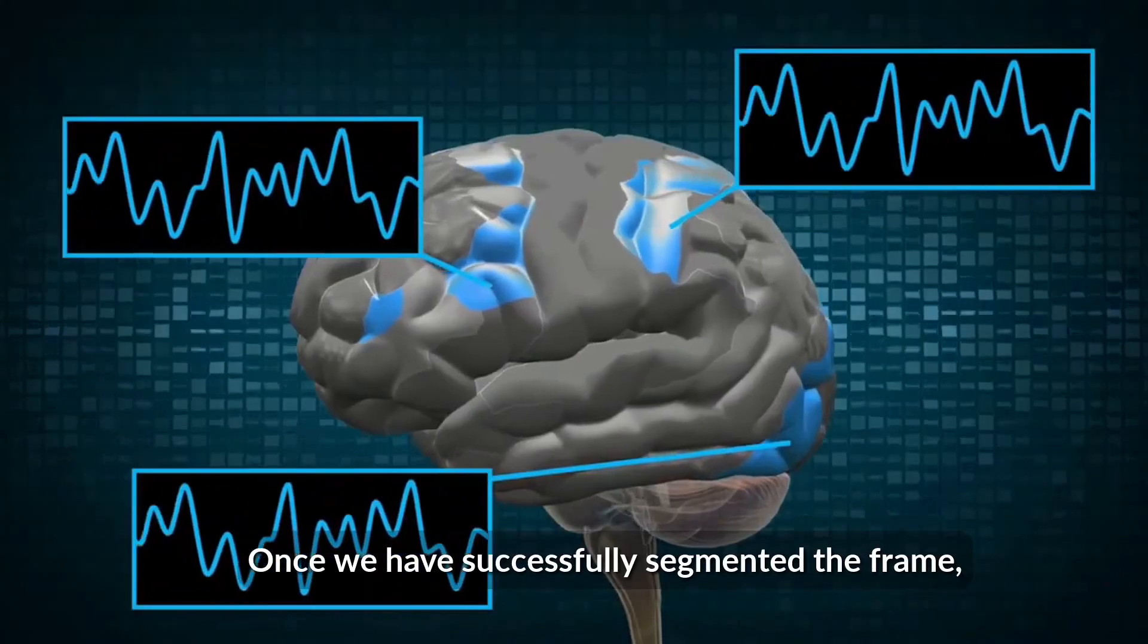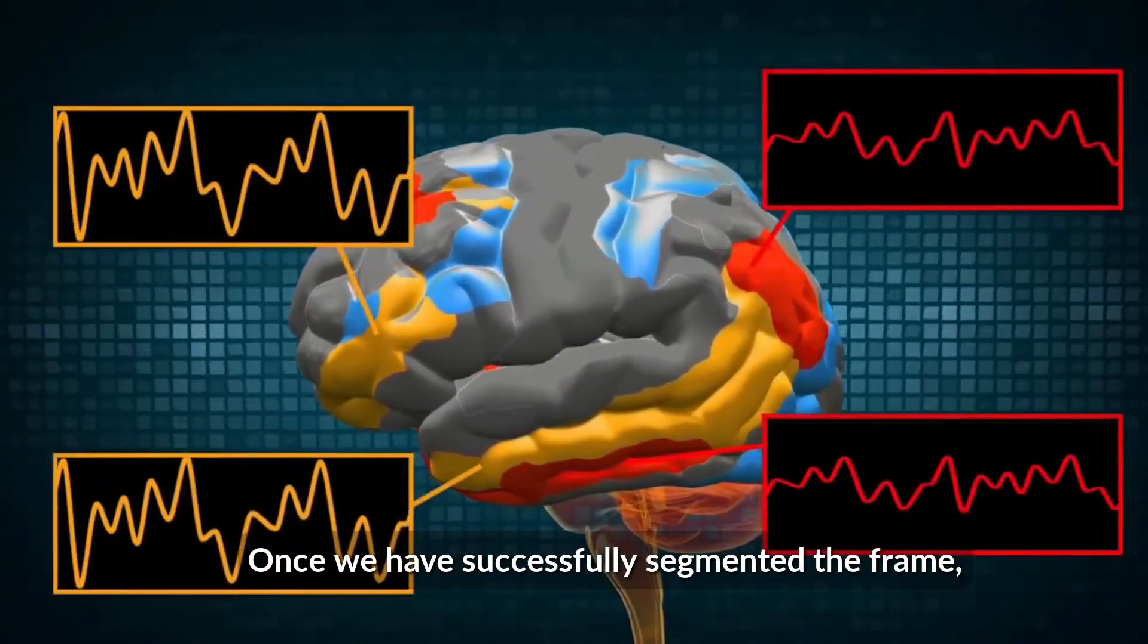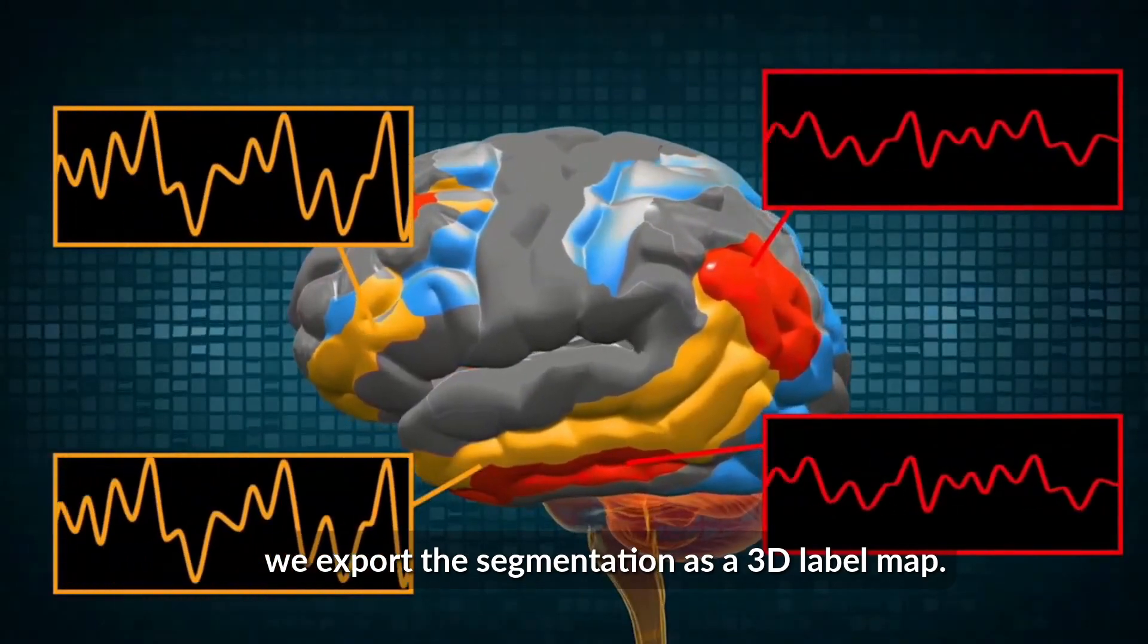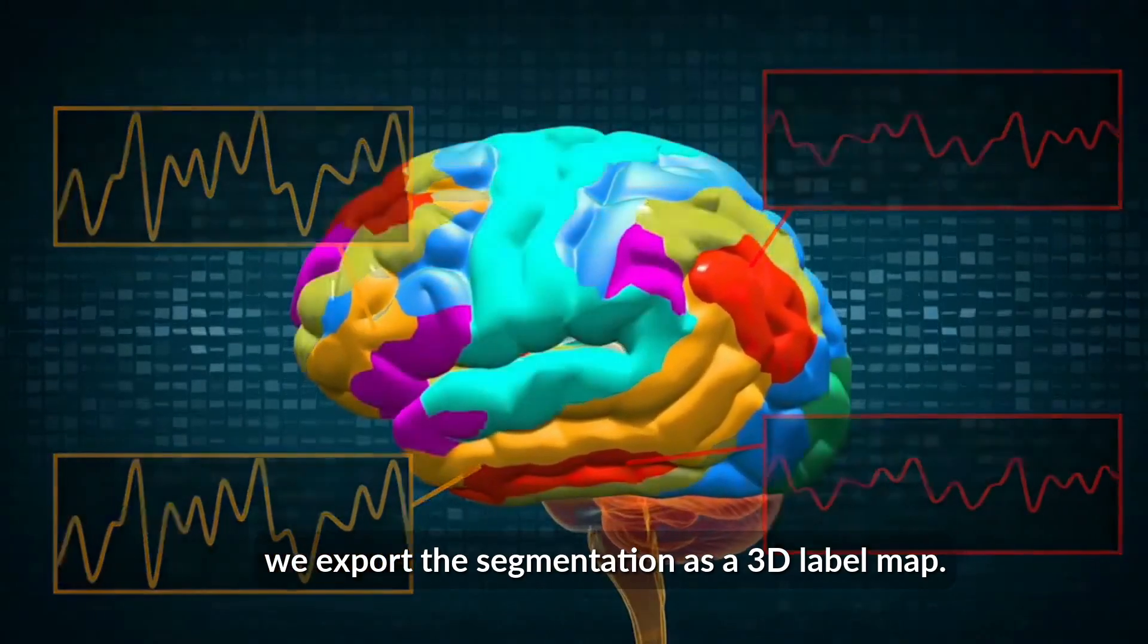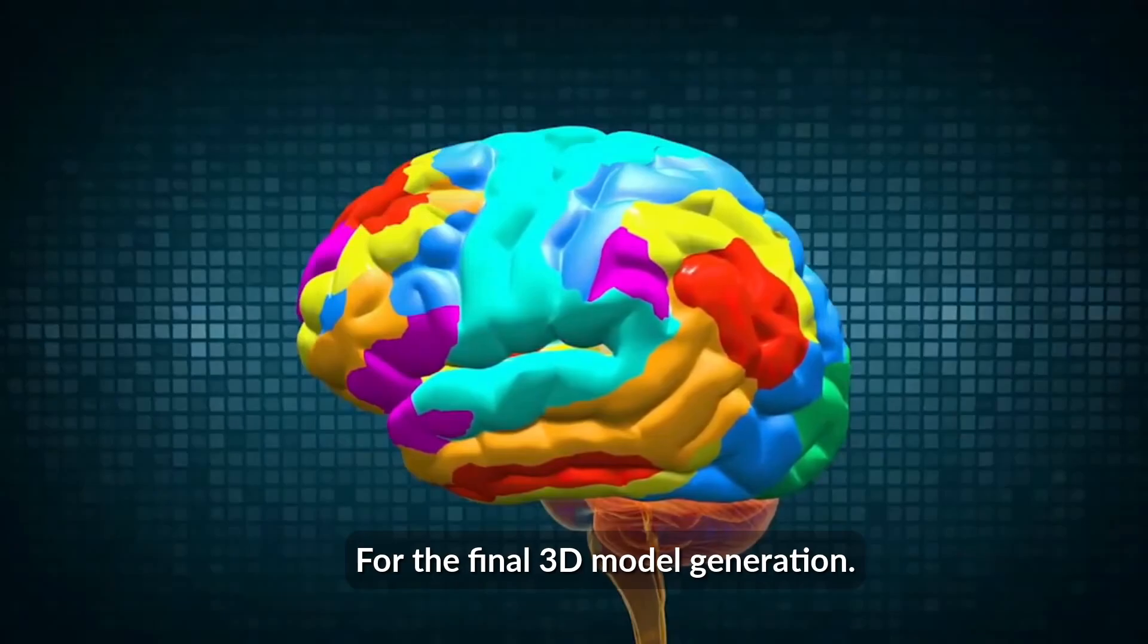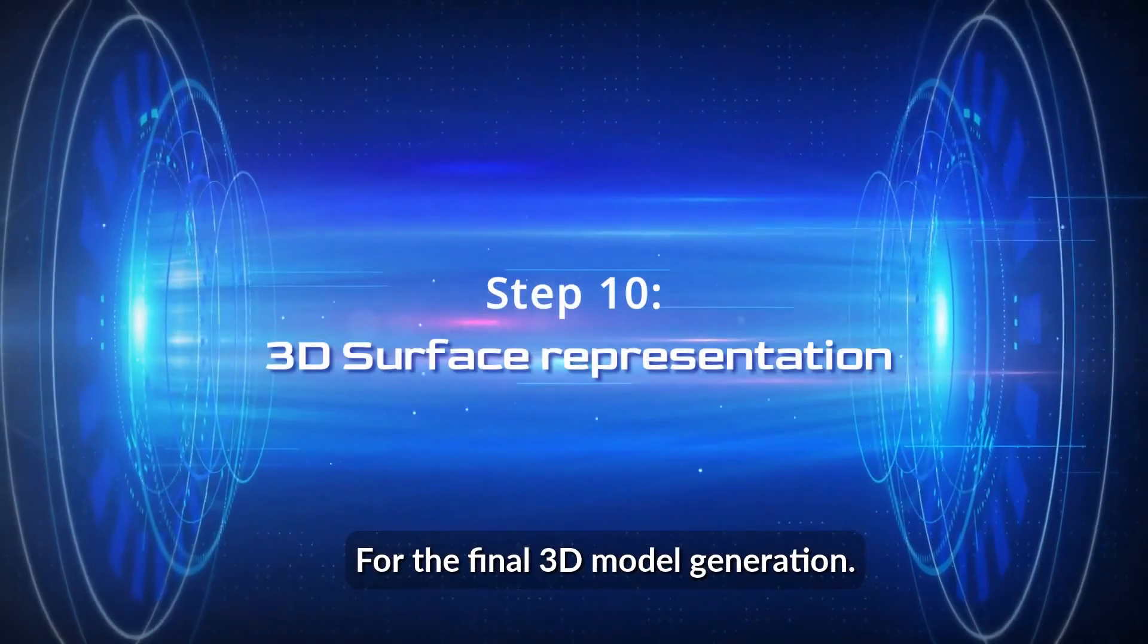Once we have successfully segmented the brain, we export the segmentations as a 3D label map. This step prepares the data for the final 3D model generation.